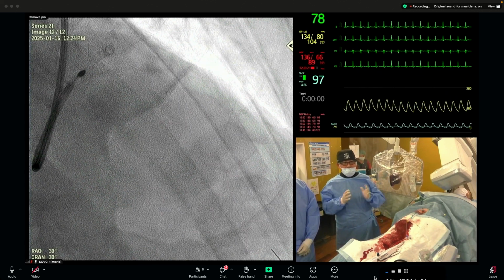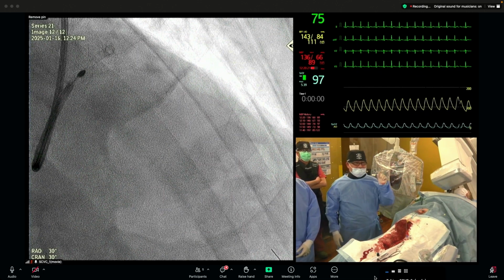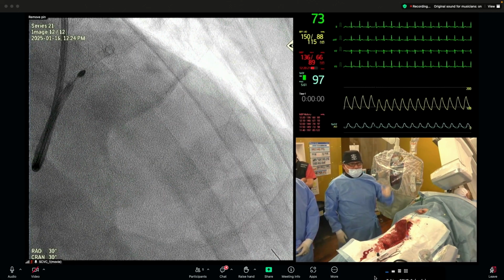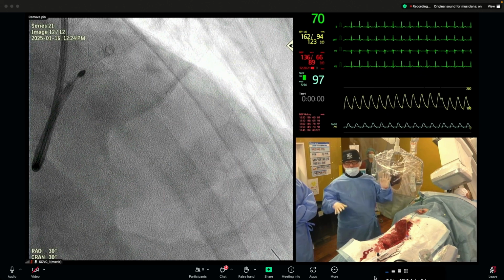However, if we can get not only acute lumen gain but also a stent symmetry index of 0.7 for DES, 1-year MACE is less than 5%, only around 4%. So that is about 5 times different.